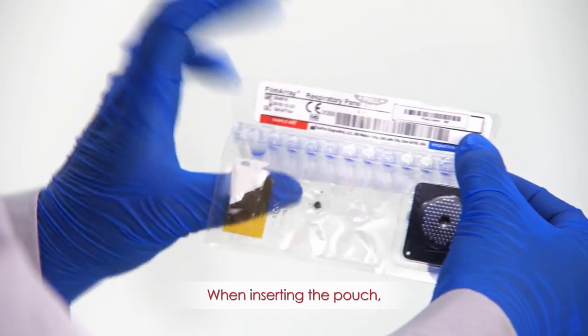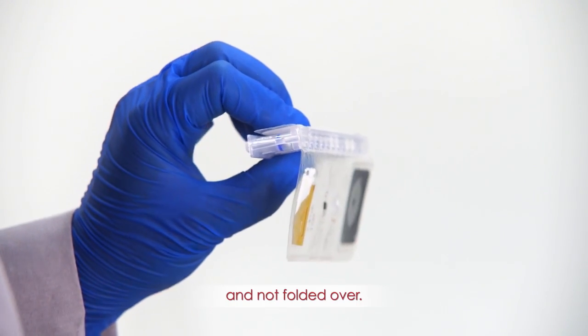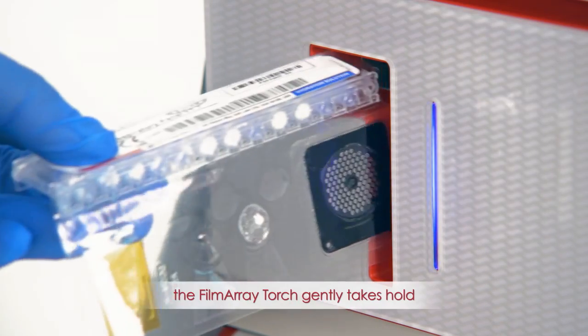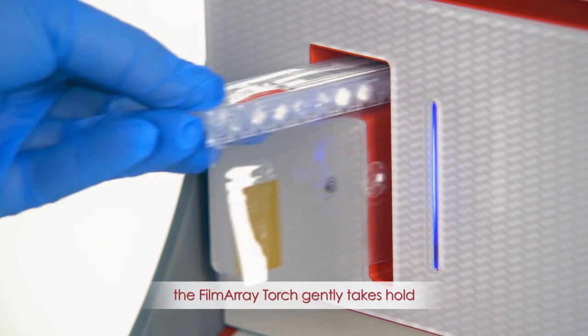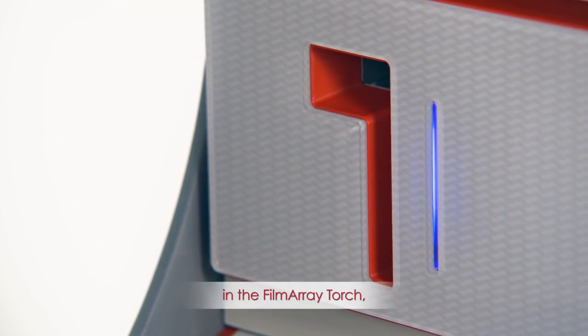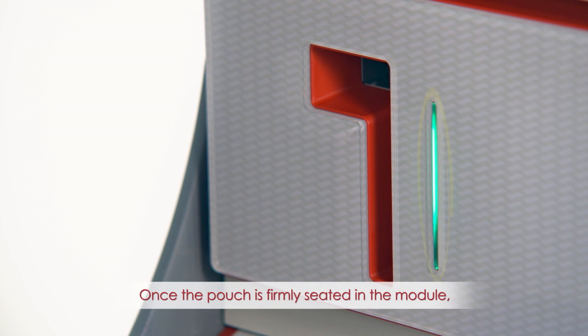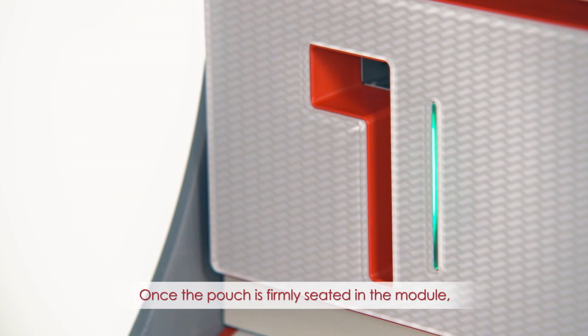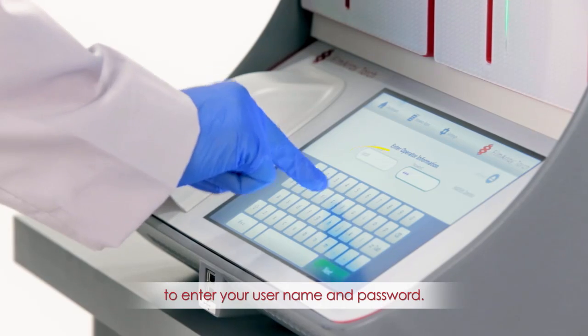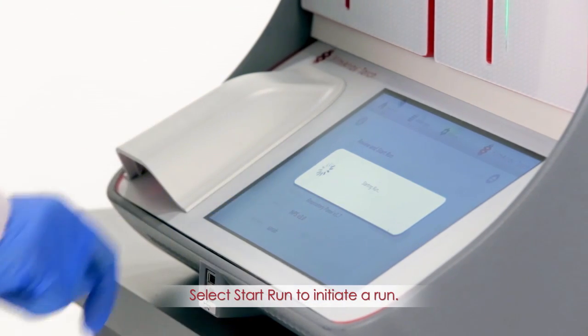Inserting a pouch. When inserting the pouch, ensure the label is flat on the top of the pouch and not folded over. As you insert the pouch, the FilmArray Torch gently takes hold and pulls it into the module. When the pouch is secured in the FilmArray Torch, the module light will flash green to indicate the pouch is properly seated in the module. Once the pouch is firmly seated in the module, the dashboard will prompt you to enter your username and password. Select Start Run to initiate a run.